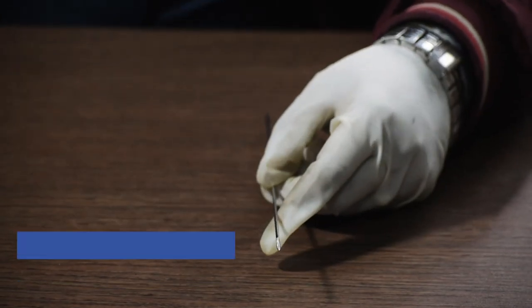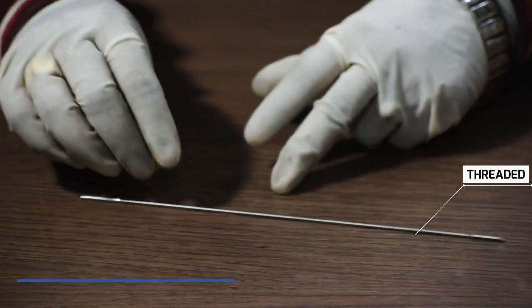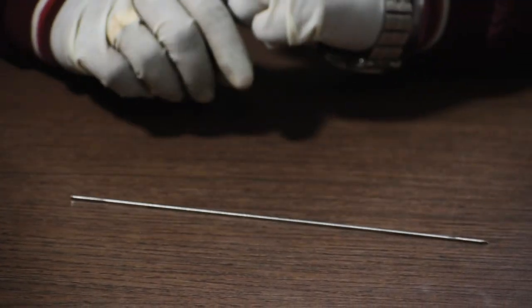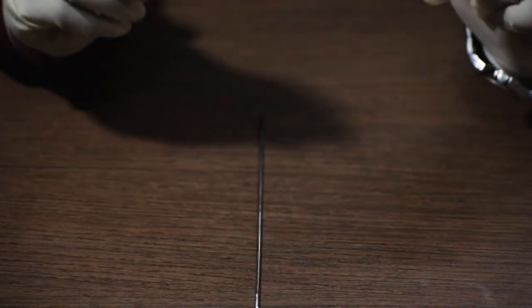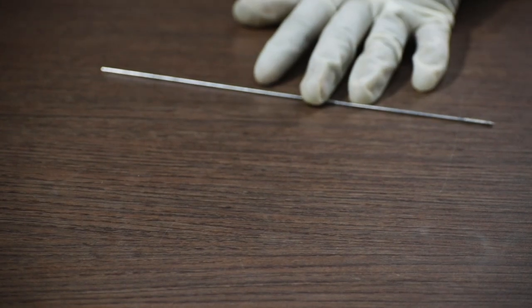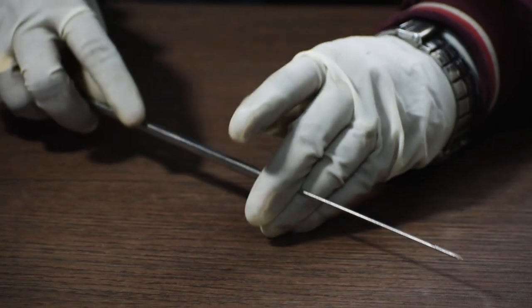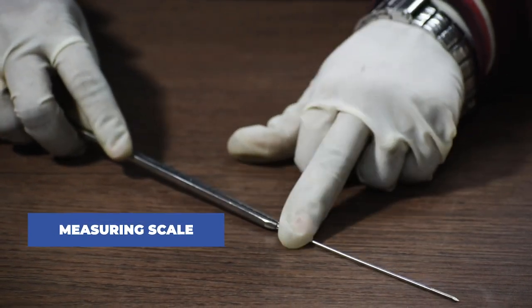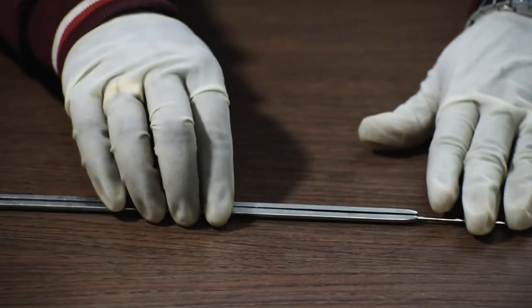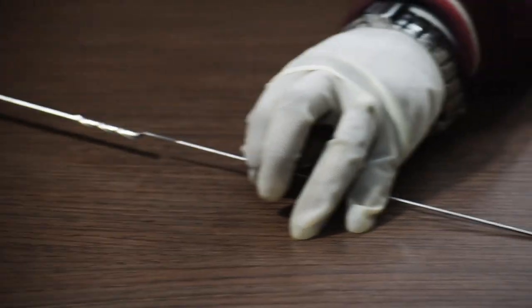Now, for the derotation screw, we will first use a 1.8mm guide wire. Then we take the measurement with the help of a measuring scale.